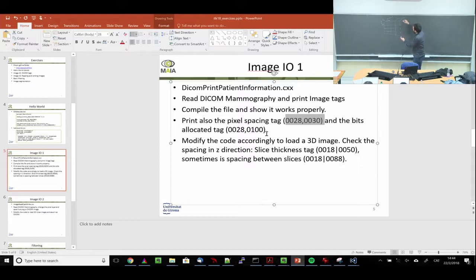And because you have several slices of this image, you have several of those. So you have another one, let's say if I'm going into this direction, very bad at drawing. That will be one pixel or one voxel if you want. If we use the center, that will be another voxel. Yeah? The same x and y dimensions, but a different z. So any reference that you used to with the voxel or a pixel, x and y, we will add a new one which is x and y and z. And it's not more complicated than this. Instead of a 2D matrix, it will be a 3D matrix. That's it. Okay? Yeah?